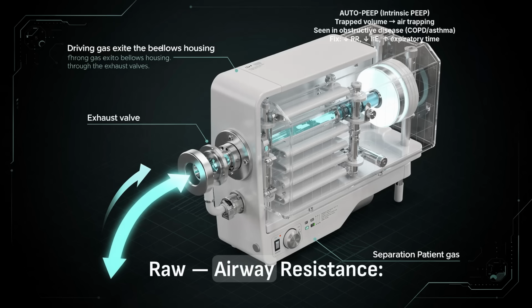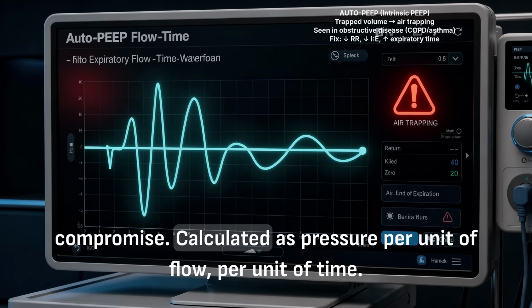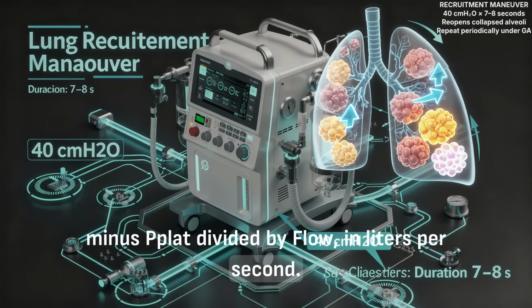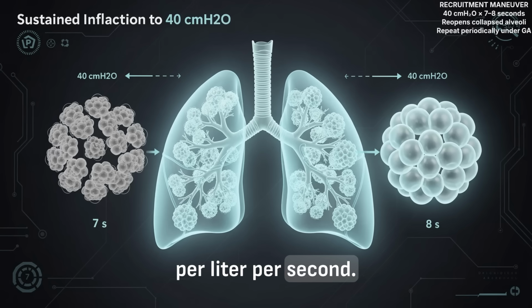RAW. Airway resistance gives objective data to consider during mechanical ventilation or in diagnosing airway compromise, calculated as pressure per unit of flow per unit of time. RAW equals PIP minus PPLAT divided by flow, in liters per second. Optimal RAW is less than 10 centimeters of water per liter per second.